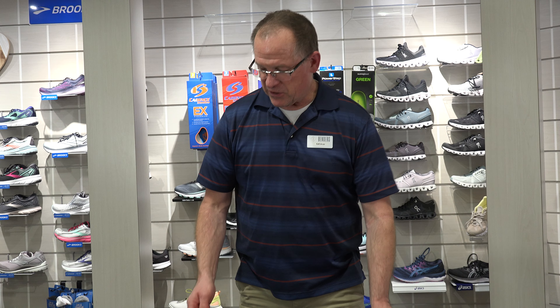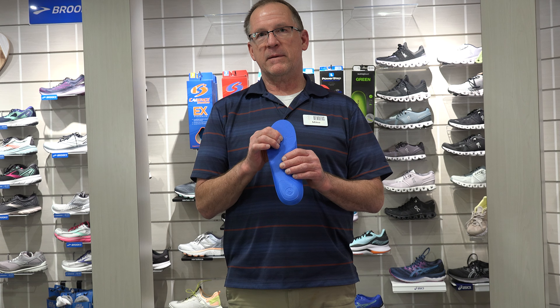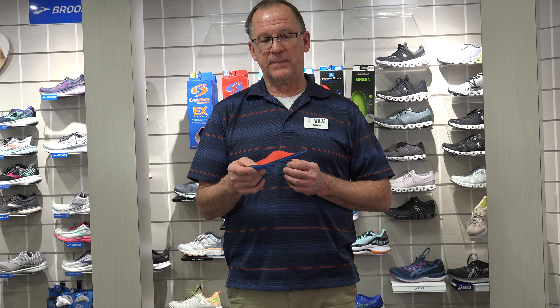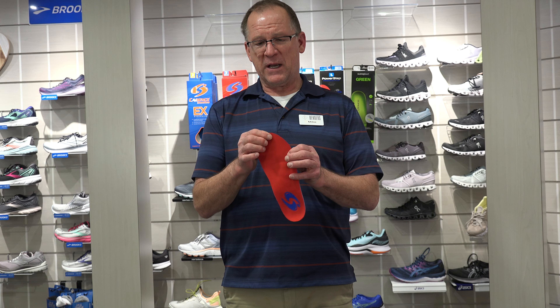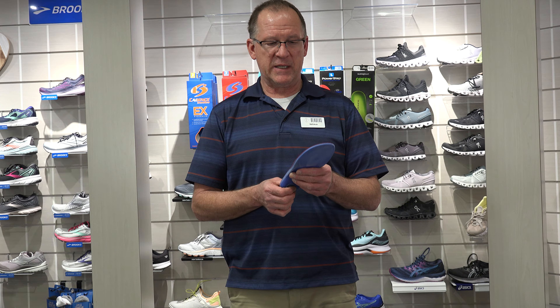The top covers of these insoles vary from about an eighth inch thick to about a quarter inch thick — that's what the foot actually rests on — and they vary in cushiness. I lean toward the Cadence because it has basically a quarter inch thickness of silicon rubber: a very, very cushy insole.